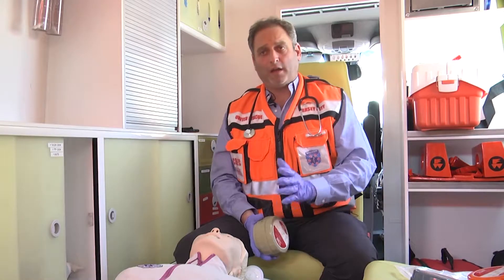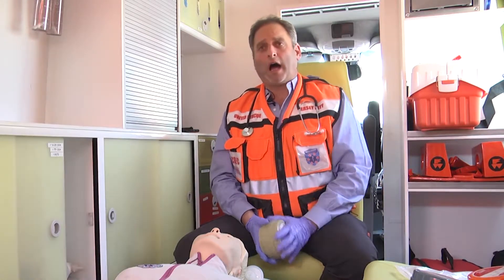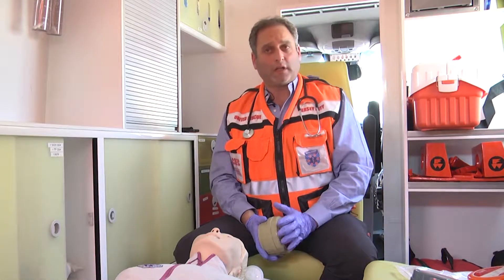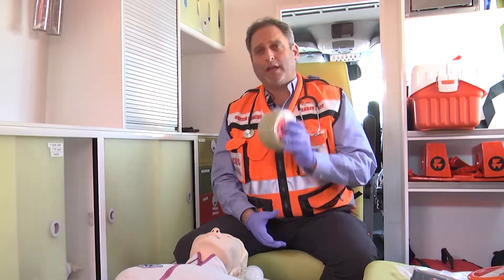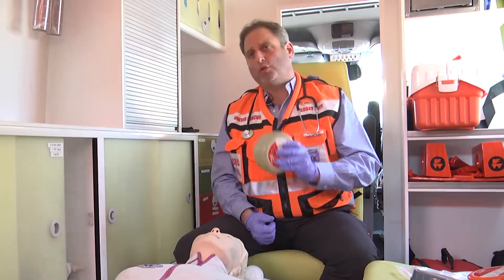I'm Dov Maisel, and I've been a medic for the past 25 years. I also operate as an IDF Reserves combat medic in the Israeli IDF forces. What I want to talk to you today is about the pocket BVM with O2 tubing.